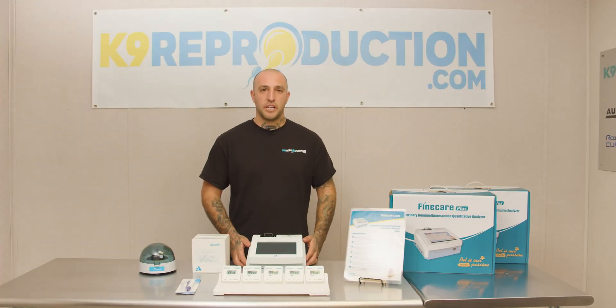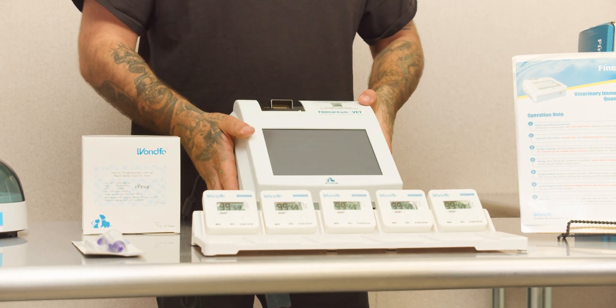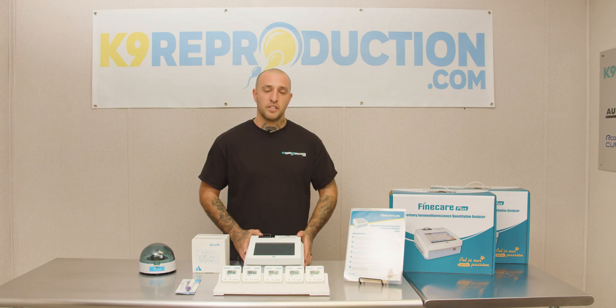What separates the WANFO Progesterone Analyzer from other analyzers on the market today? A few key features we like: the built-in LCD display, the built-in thermal printer, and a 15-minute runtime for each test.